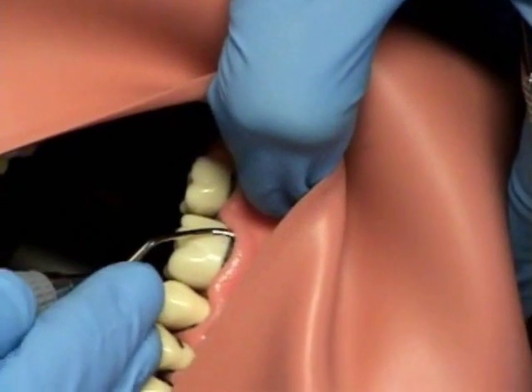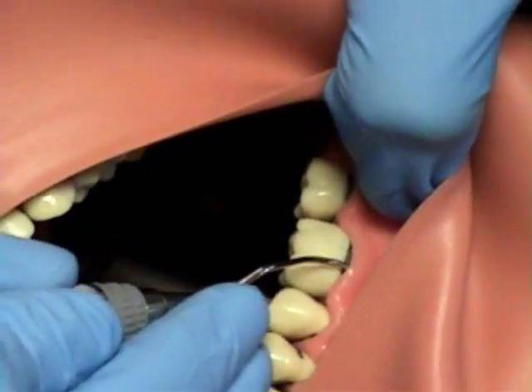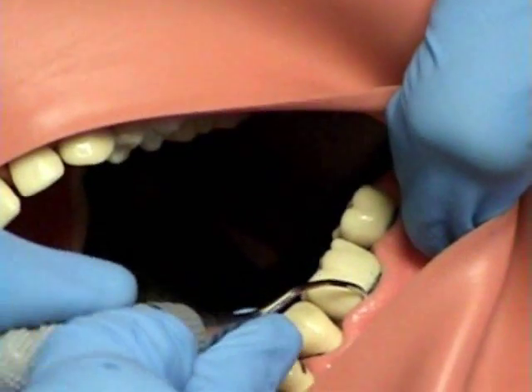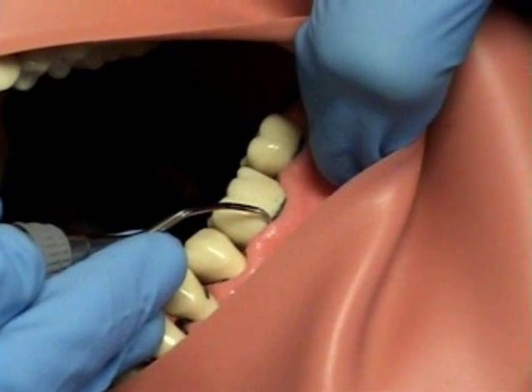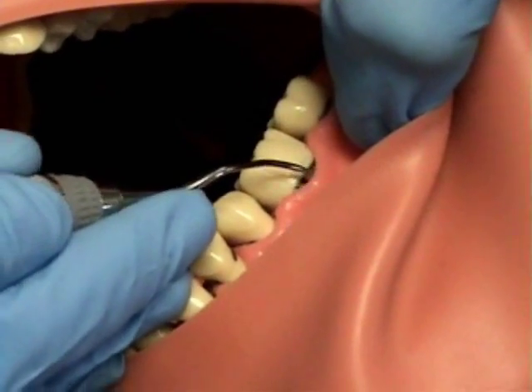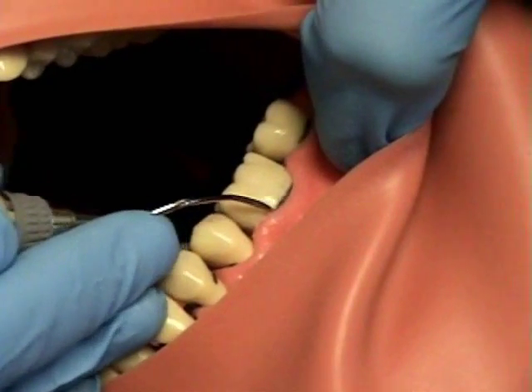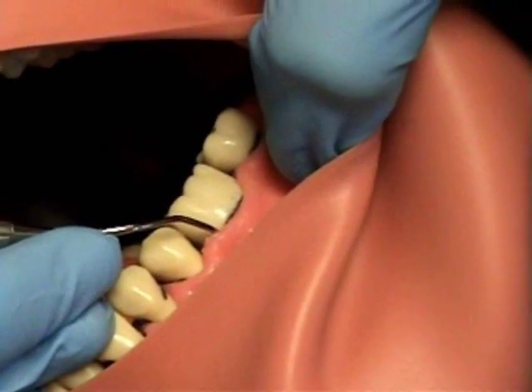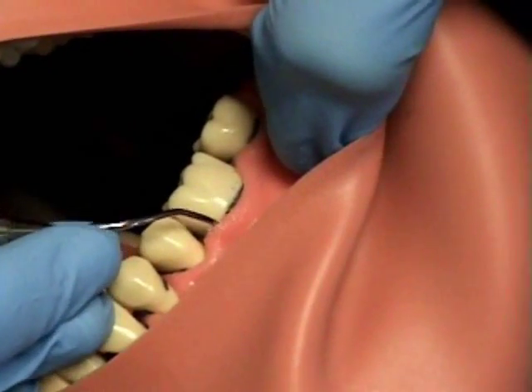It's very important to keep a very close eye on your angulation. When the blade is open, the terminal shank is not parallel to the long axis of the tooth. So unlike your Gracey curettes, it is not a self-angulating instrument. In other words, when the blade is open, you cannot tell whether you are at 70, 80, or 90 degrees. If you're at 90 degrees, laceration is possible.